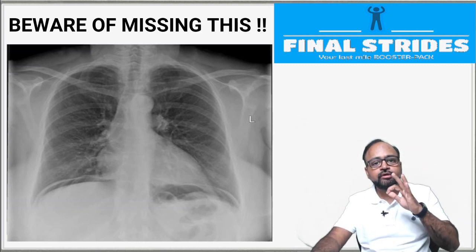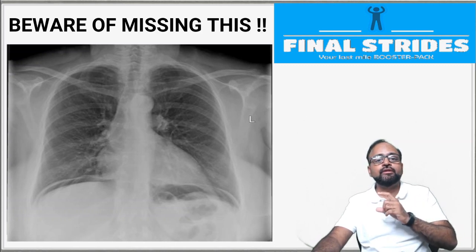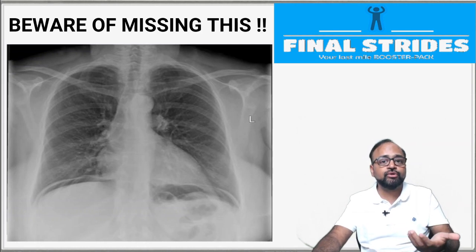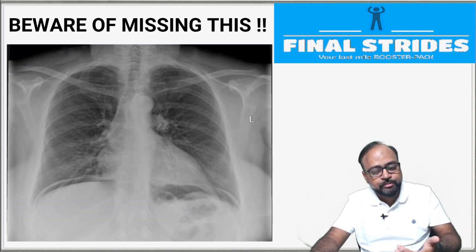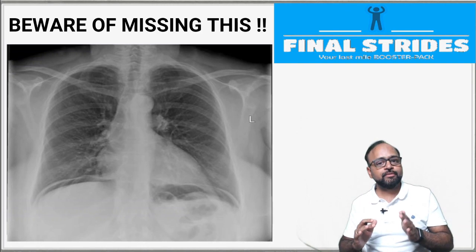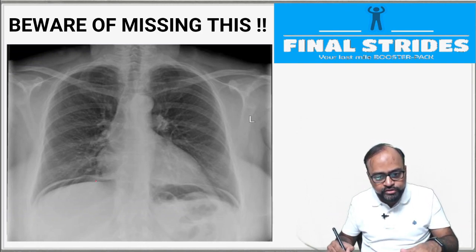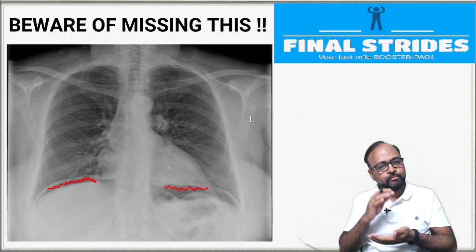You should not afford to miss this, right? You cannot afford to miss this, because if you miss this, not only will you get this MCQ wrong, but that doesn't matter much, but the patient might lose his life. Because with a few hours delay in treating this patient, the patient would go into septic shock and you may lose the patient. So whenever you're looking at a chest X-ray or an abdomen X-ray, make it a point that you look at the diaphragm and try to look for this free air under the domes of diaphragm. If you see free air under the dome of diaphragm, you clinch the diagnosis of pneumoperitoneum, perforative peritonitis.